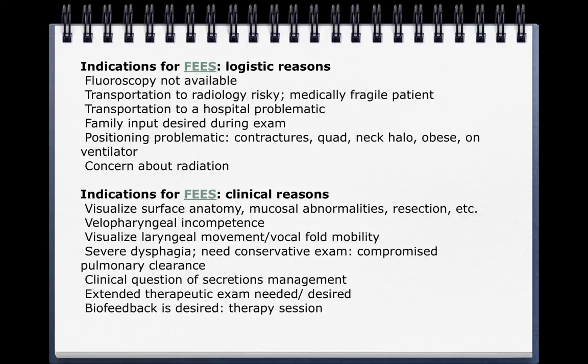If somebody has very, very severe dysphagia, and all you really want to know is, is the airway compromised? Is there material that's entering the airway? Then, again, this might be a logical, quick, non-irradiating kind of measure. It's going to show yes or no, is there aspiration?